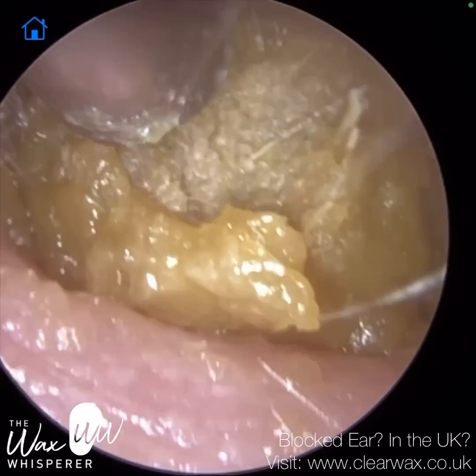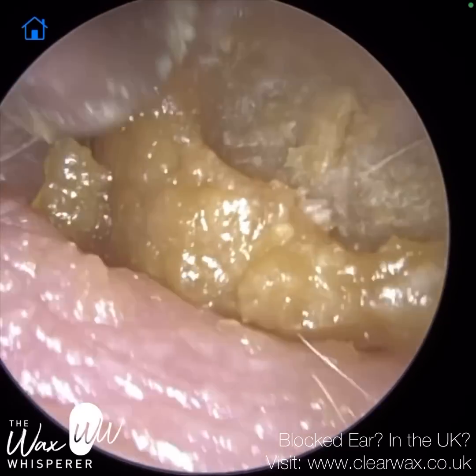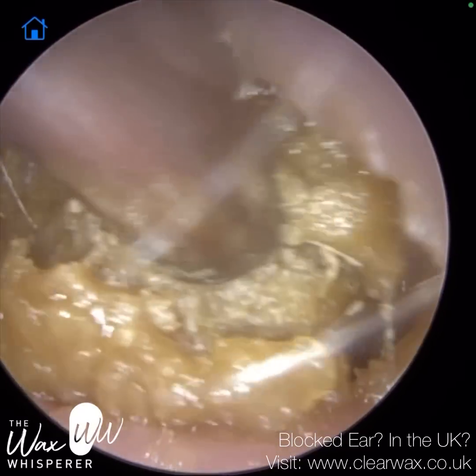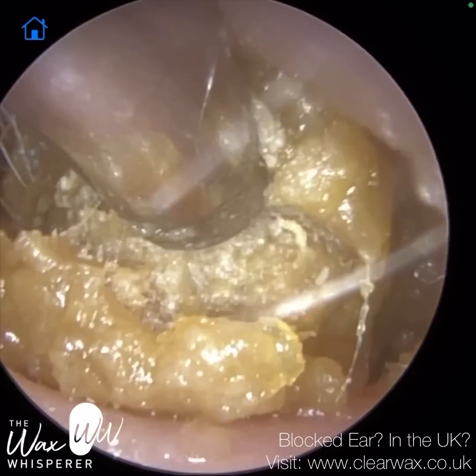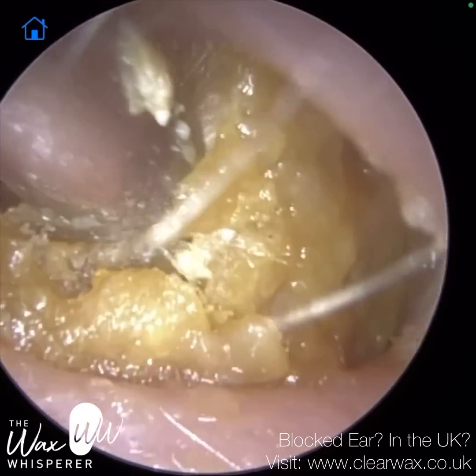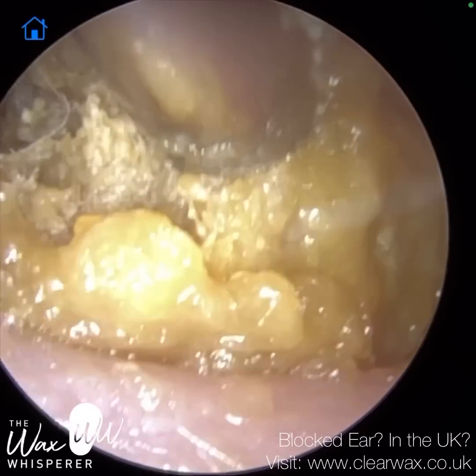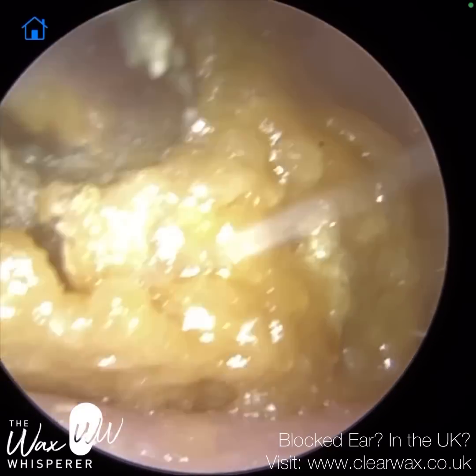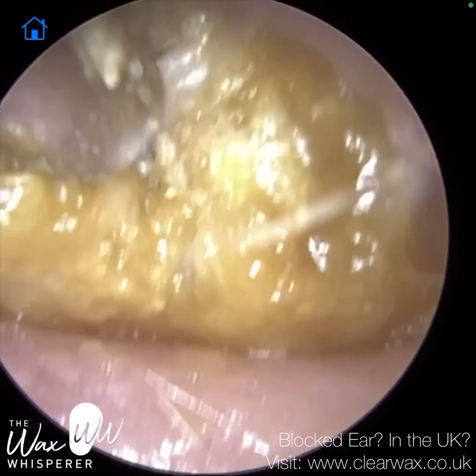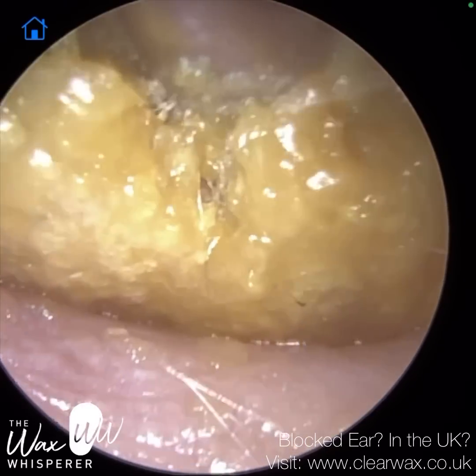Just trying to squeeze this through the entrance of the ear — they have got a bit of a narrowing here, and the wax plug is actually larger than this section of the ear canal, so just teasing it through. In this video, you're going to see a zoom function that I've been working on, which allows us to zoom in a bit closer to what we're removing.